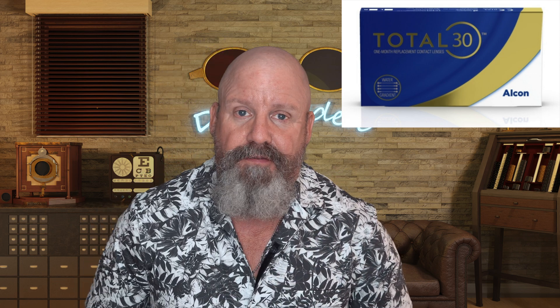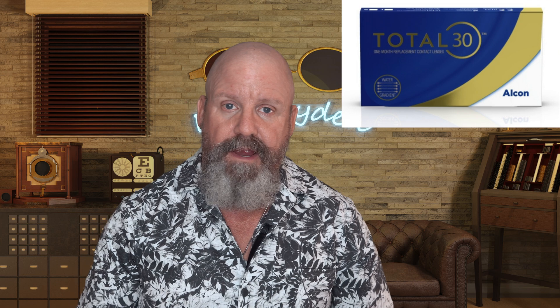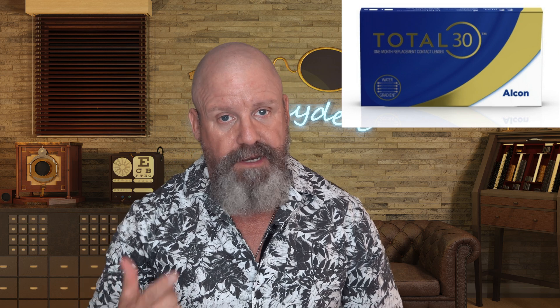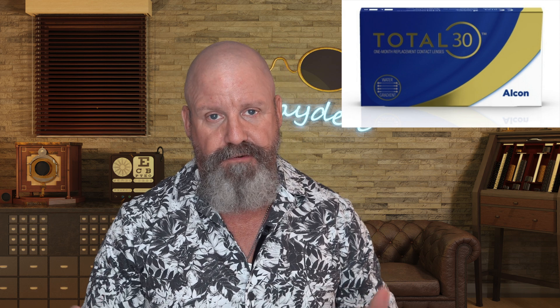Today all of those issues — the dryness, the wettability of silicone lenses, and the vision problems — are going to fall to the wayside with this new lens. Here it is. It's called the Total 30 by Alcon. It is a daily wear monthly lens. So you put it in in the morning, take it out, store it in contact lens solution, and you repeat that for the 30 days of the lens.